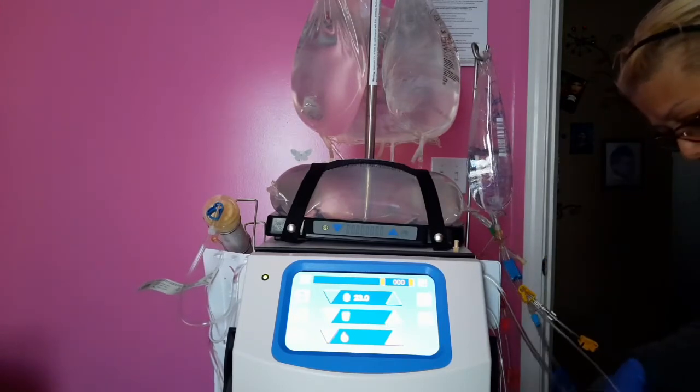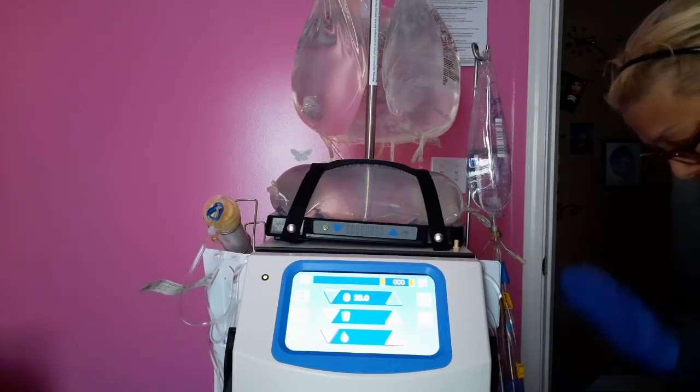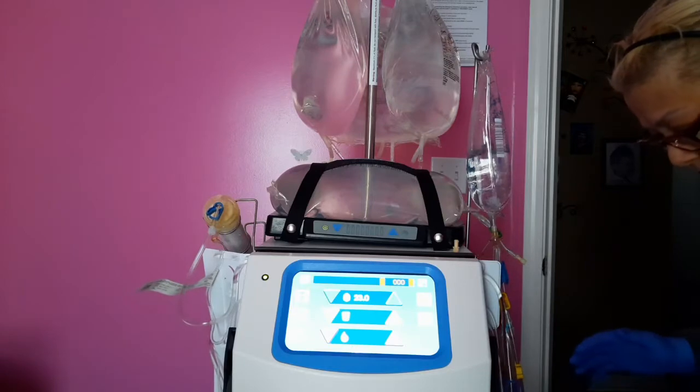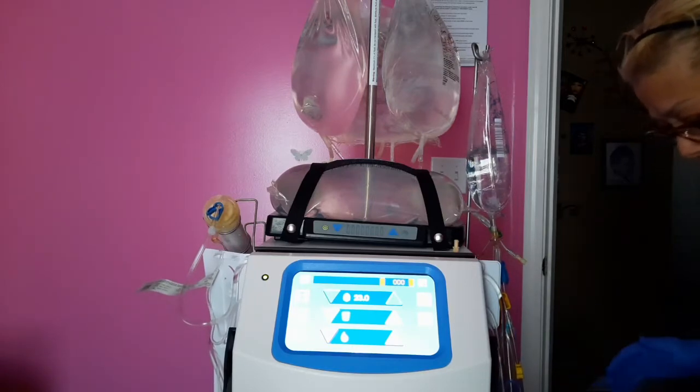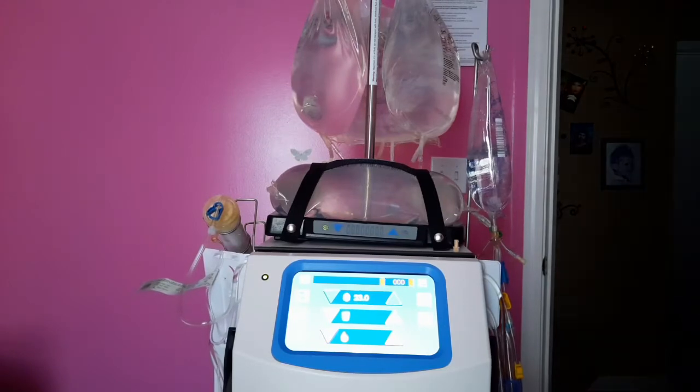This is what I mean, how your lines always get tangled no matter what. Tap, tap, tap. Flip, flip. Tap, tap, tap. Flip, flip. Tap, tap, tap. Flip. Alright, now back to the dialyzer.